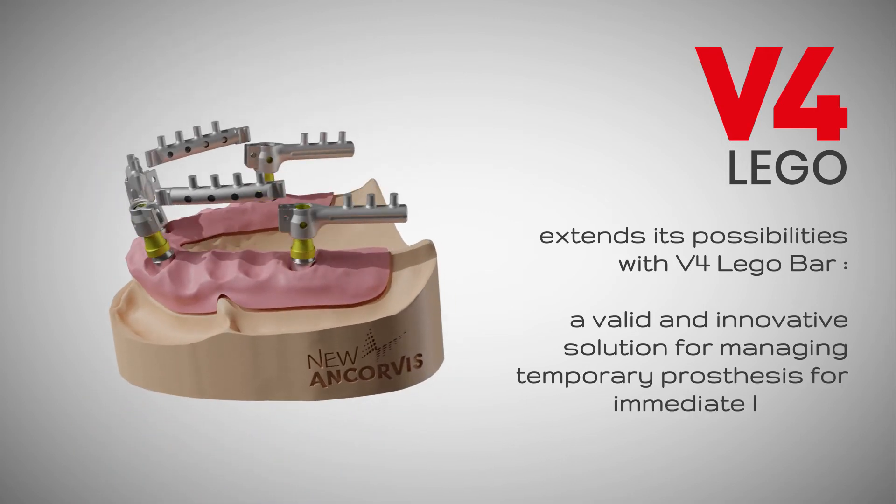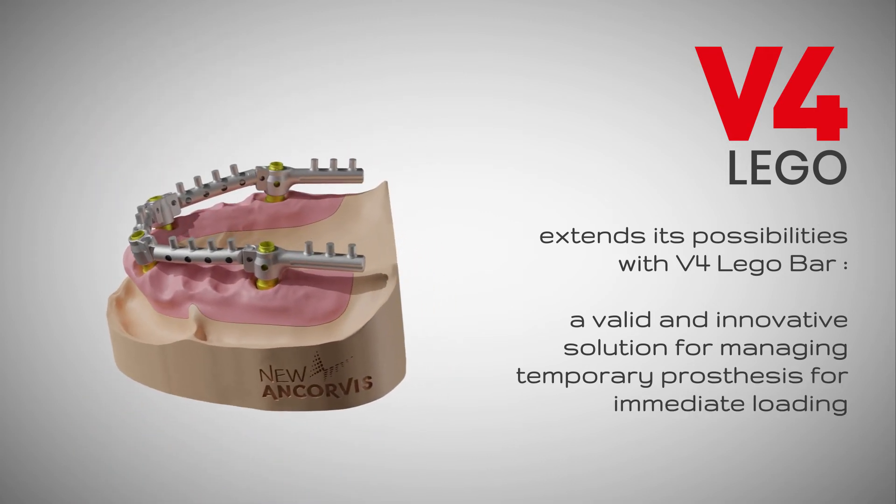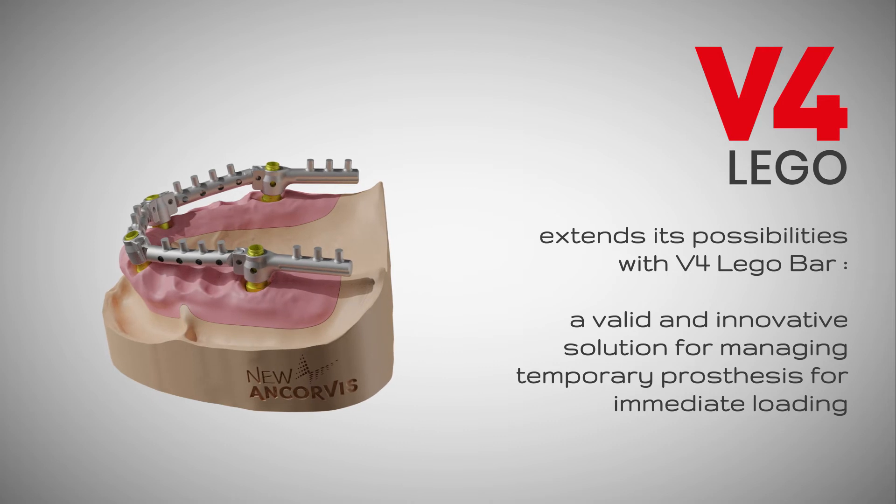VuQuattro LEGO Bar consists of multiple components which can be interchanged: threaded joints with variable angles, telescopic elements, end joints, and cantilever joints.